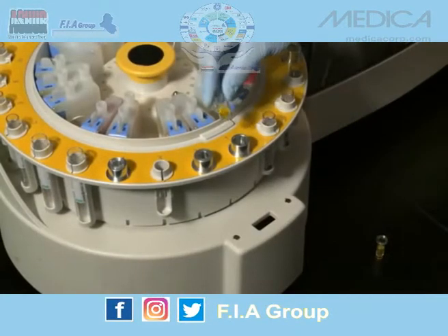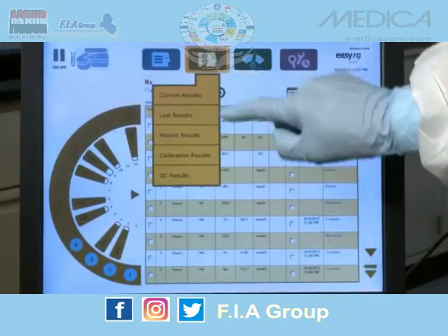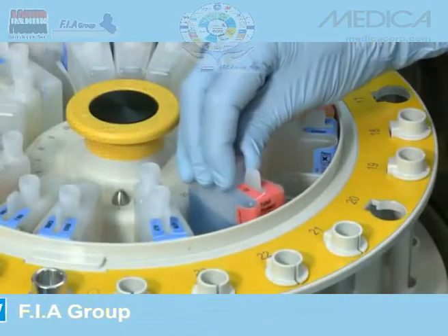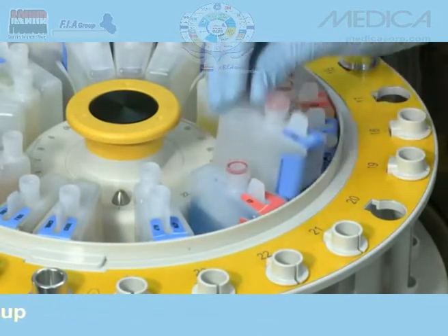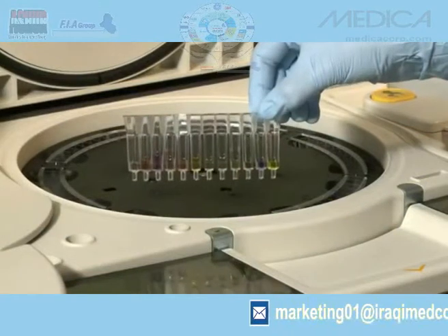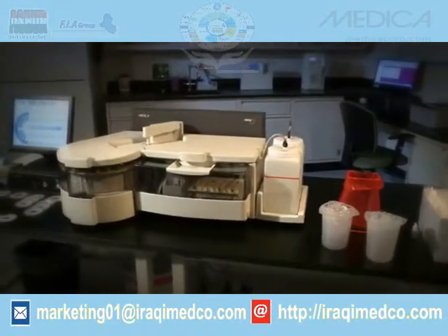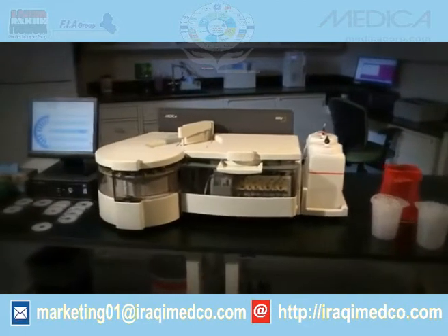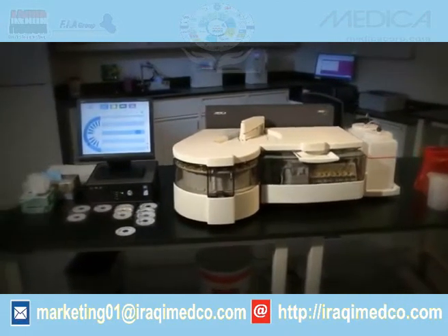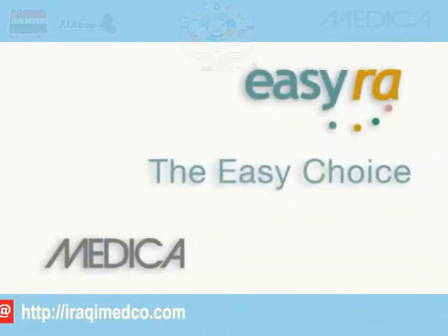EasyRA is your complete solution for clinical chemistry analysis — saving you time with an intuitive user interface and convenient reagents featuring two-way RFID communication. Disposable cuvettes mean accurate results every time. Medica Corporation addresses the needs of today's laboratories by maximizing these efficiencies. Be in control with EasyRA. It's the easy choice.